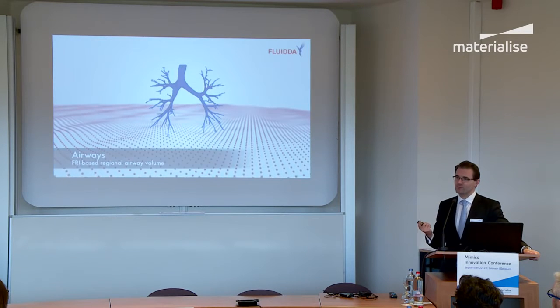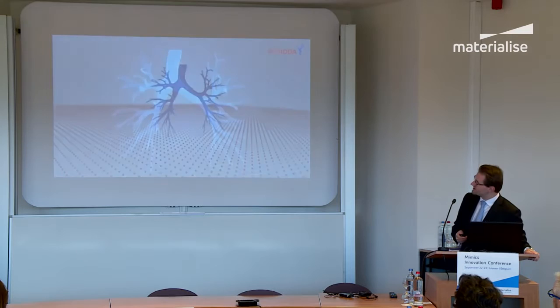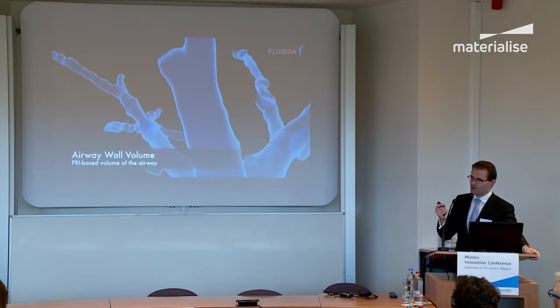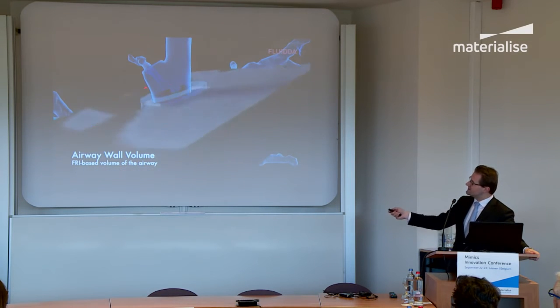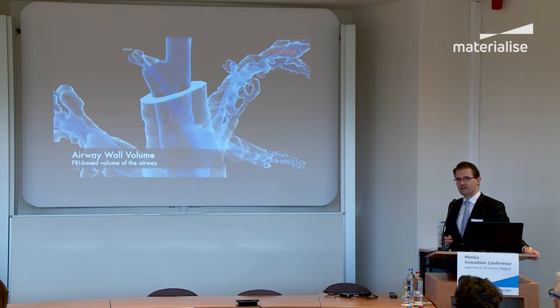We look at the airway caliber, which we can then relate to the regional ventilation pattern of an individual patient. And we can also look at the airway wall volume. So you often see in asthma or CF that the airway wall is thickened due to inflammation, bronchiectasis, etc. So what we do is we look at the lumen, we revert back to the CT scan, and we can look at the surrounding structure that builds up the airway wall itself.